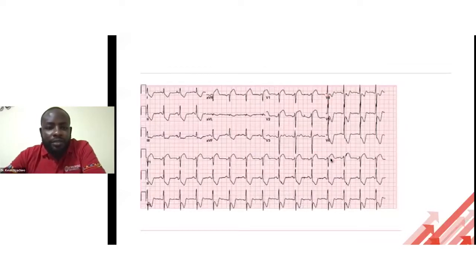50-year-old man comes in with severe, describes it as a feeling of tearing chest pain. Pain is going to the back. You've given paracetamol, you've given tramadol, you're on the verge of giving morphine. Pain doesn't seem to be affecting. Whatever you're giving is not even touching him. Okay, pain is out of proportion.